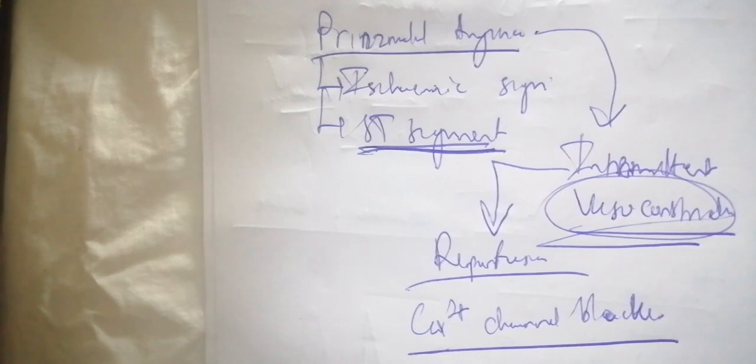We now move to the next aspect, which is going to be the pathologies of conductivity.